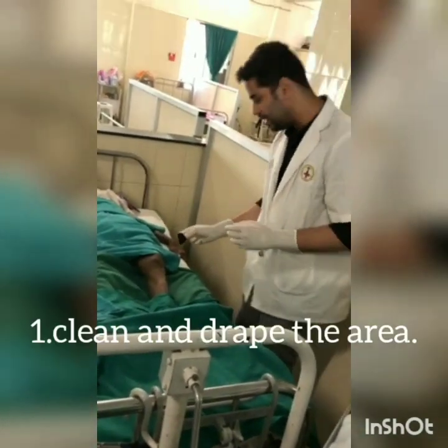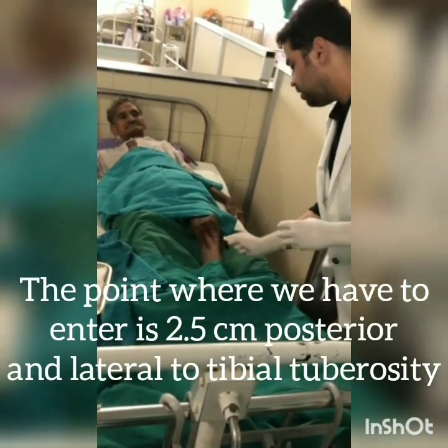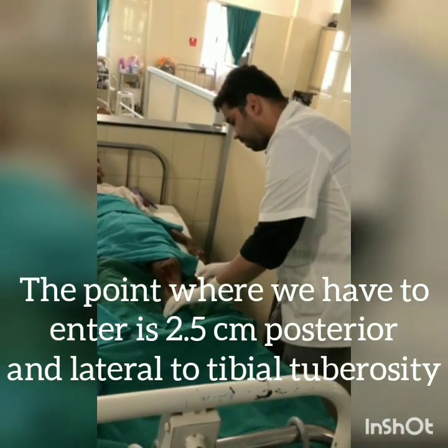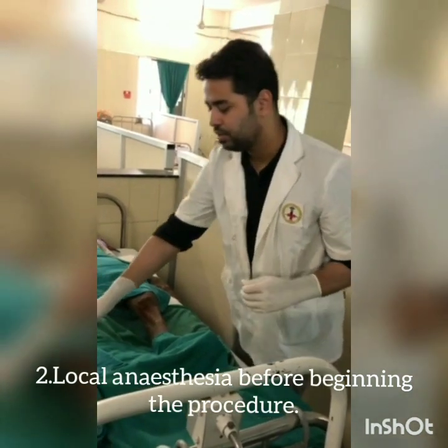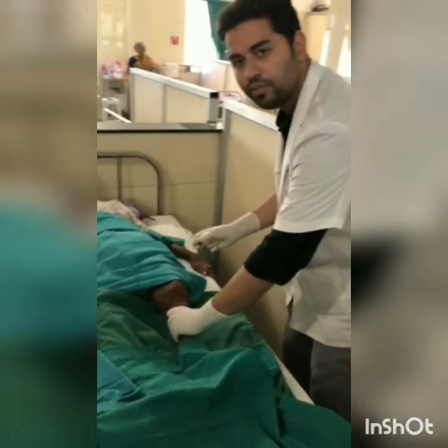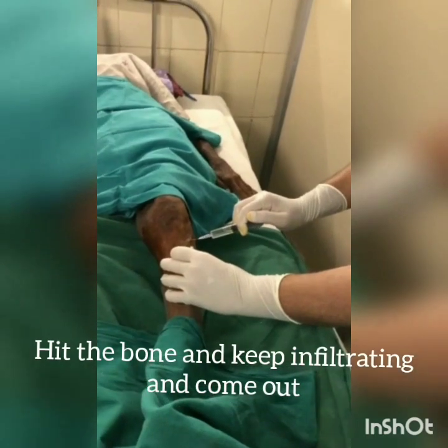First we have to clean and drape the area. The point from which we have to enter is 2.5 cm posterior and lateral to the tibial tubercle. First we have to give local anesthesia, infiltrating 2.5 cm. We have taken local anesthetic lignocaine, which I am going to infiltrate from the entry point. We have to hit the bone and then infiltrate and come from that point outward.